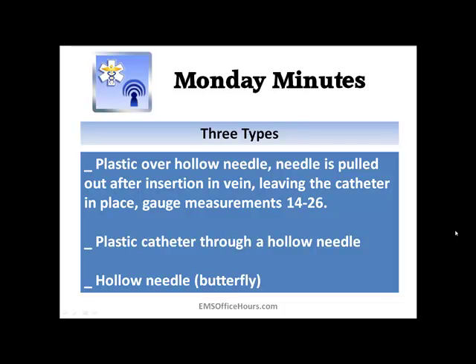It's the needle system where it's maybe spring loaded, or maybe you advance the hub of the catheter, the needle catheter, which advances in, then the needle will retract. All right, all different types of different needles out there right now, and catheter, the needle catheter combination, which makes it needleless. But the overall idea is that the catheter is that plastic catheter that's over that hollow needle. Okay, and the needle comes out after you get into the vein.